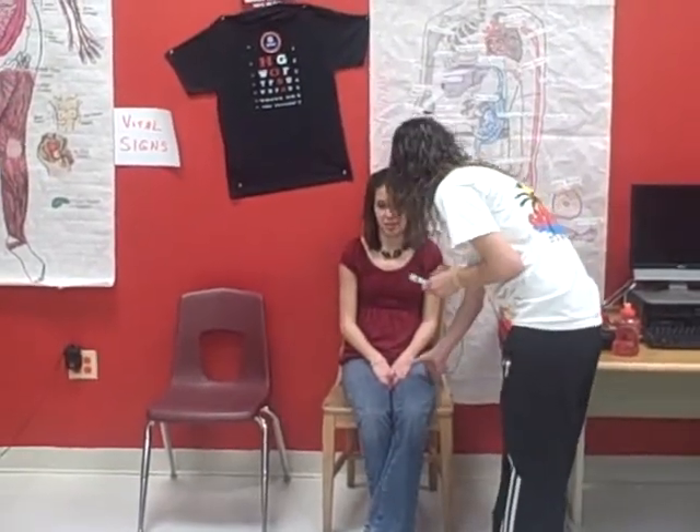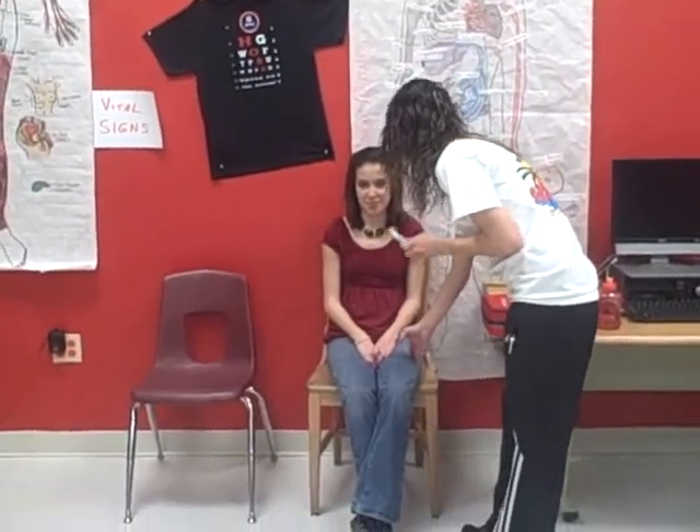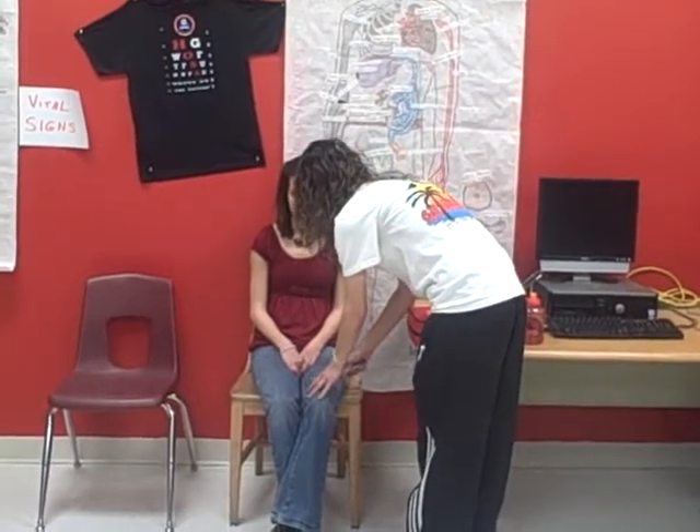I will prepare the site and insert it right here. This is your 0.3 milligrams of epinephrine, expires 2/11 of 2010. I will remove the cap, insert it, and press and hold it for 10 seconds.